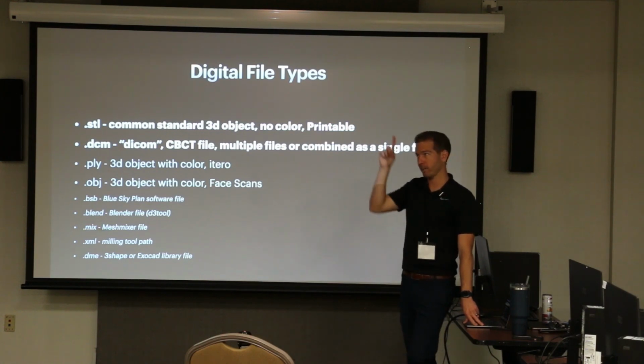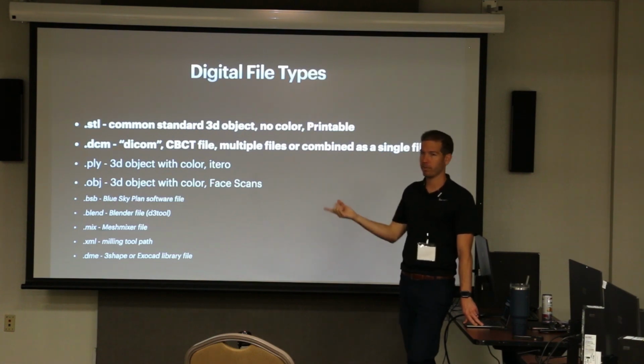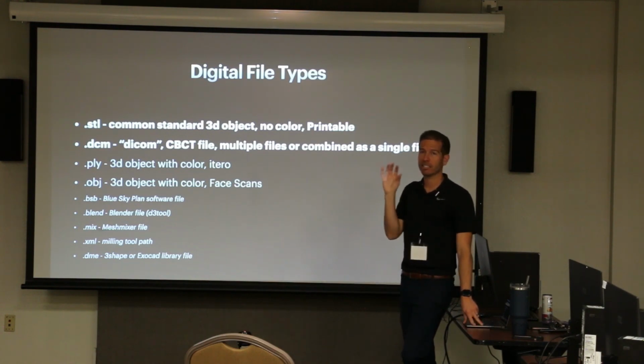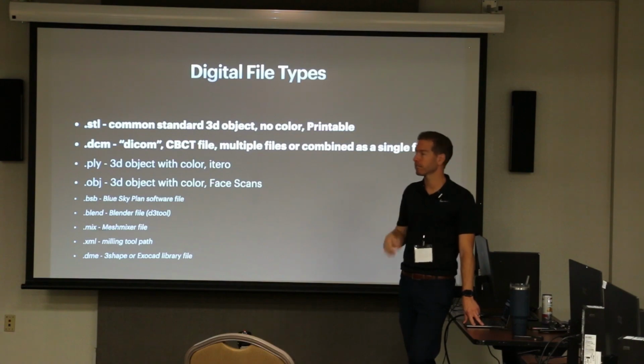You can't just hit File Save on a software, save it as a Blue Sky file, and think it can get printed. There's a difference between a Blue Sky file and an actual STL. So if you save a file, it's going to save it as a software file. If you export a file, you get to call it an STL. So just remember, think export, not save.